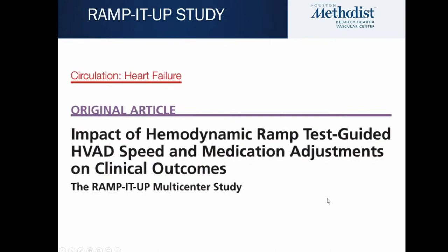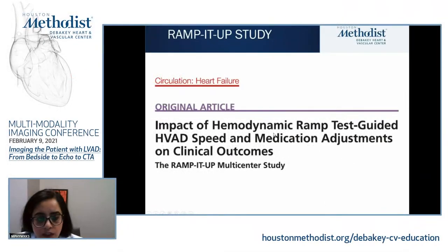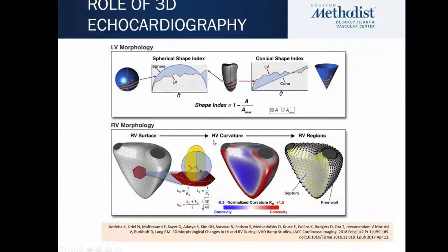And there is a clinical correlation of hemodynamic ramp assessment with clinical outcomes, as I mentioned earlier, and patients who do have better hemodynamics actually do better in the long term. Now, is there a role for 3D echocardiography?